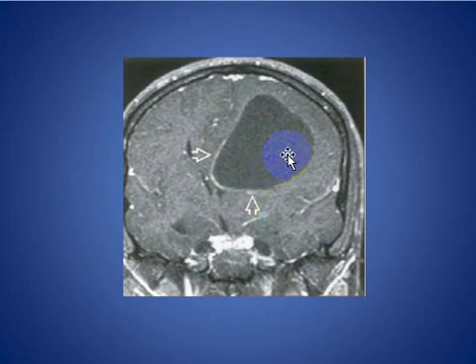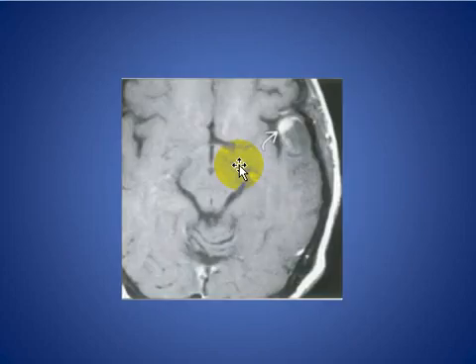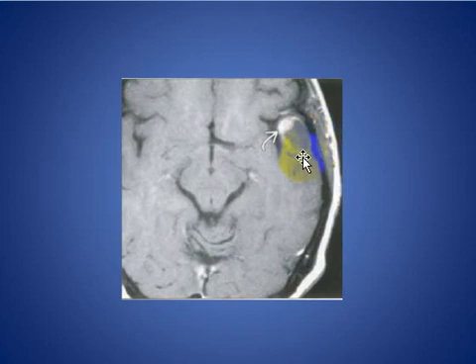The cystic lesion is in the left frontal lobe, compressing the frontal horn of the lateral ventricle — typical for ganglioglioma. Here is another ring-enhancing lesion with nodular enhancement, a classic appearance for ganglioglioma.